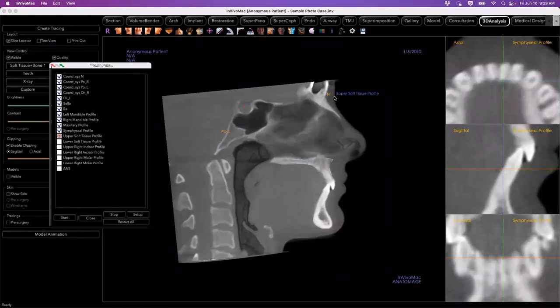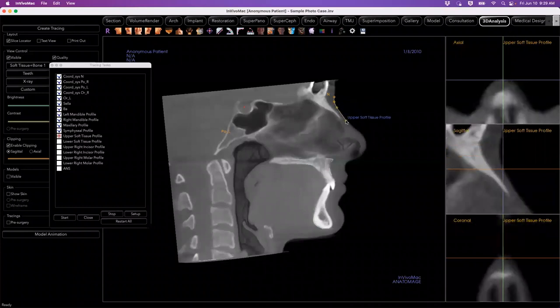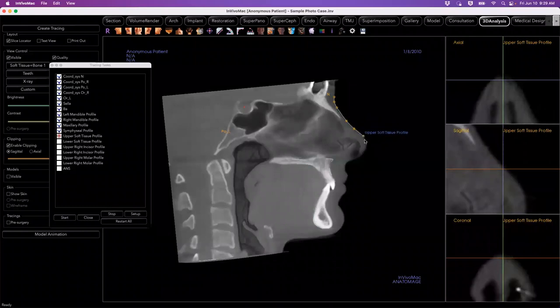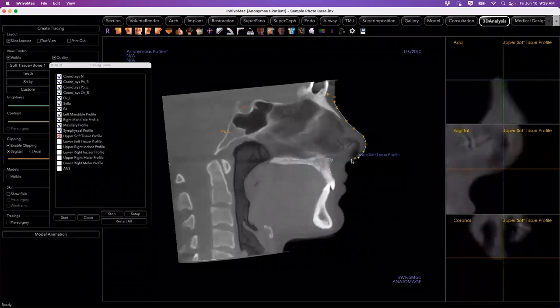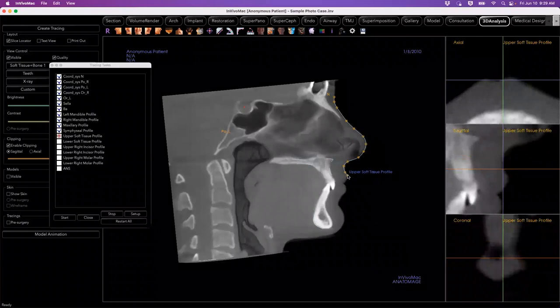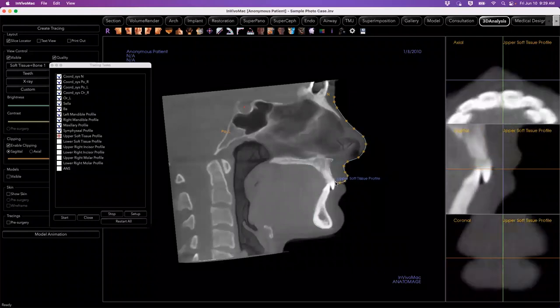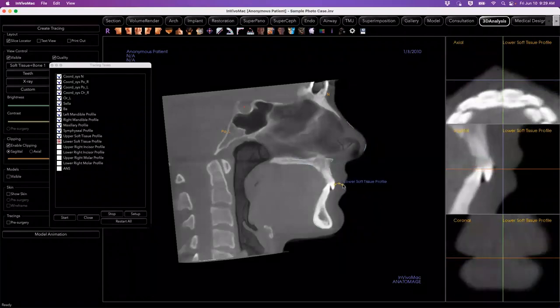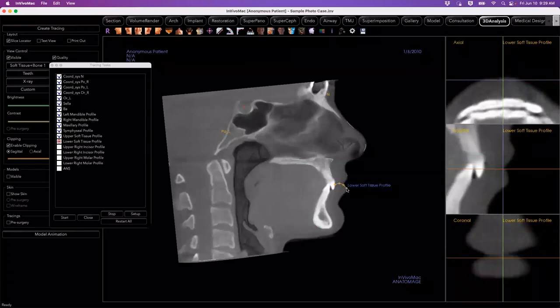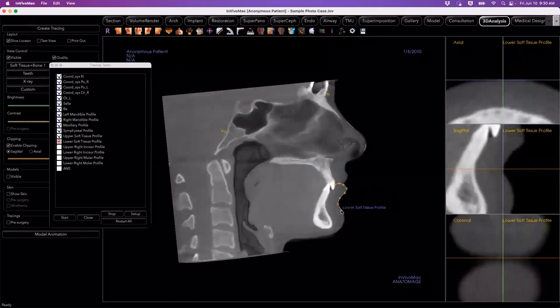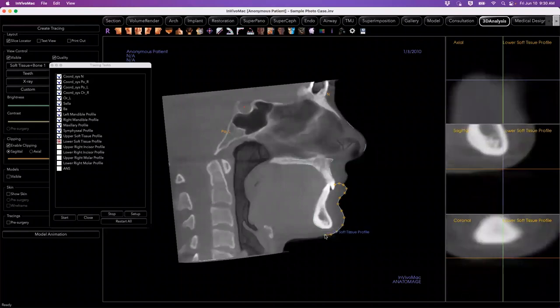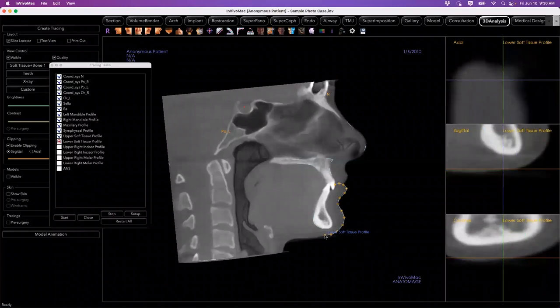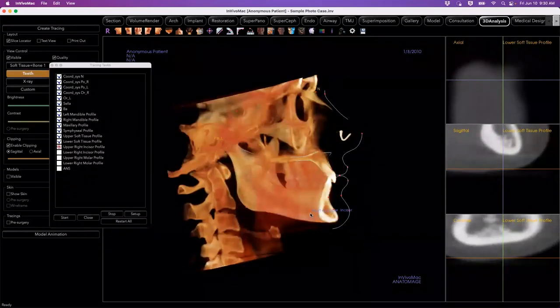Starting at the soft nasion, making our way around, using the 2D to make sure we are on the soft tissue. We come around the upper lip and end where it meets the incisor, then for the lower, starting where the lip meets the tooth, coming around the lower lip and going around the chin. One recommendation: if possible, avoid having a chin rest in play for your patient — that will allow for a more accurate definition of this chin area, as it will not interfere with your specific case.